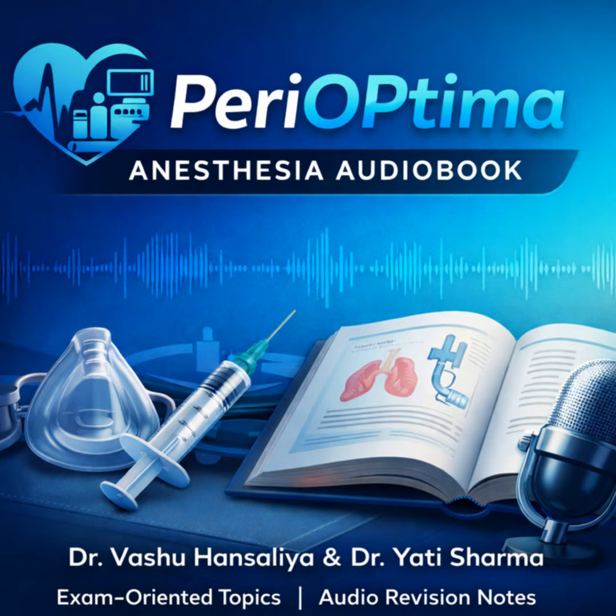Exactly. Oxygen control knobs are green or white, and they have a unique physical texture and size. This differentiation means the clinician can identify it immediately and confidently, even in dim lighting or during a high-stress, rapid response scenario. So you don't accidentally adjust the wrong gas flow. It's all about redundancy, using visual, tactile, and positional cues all at the same time.